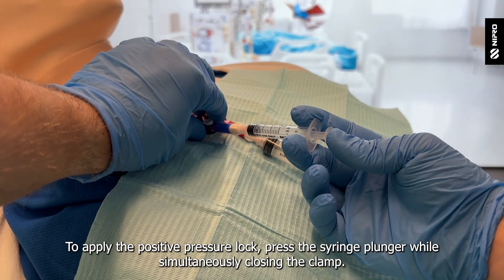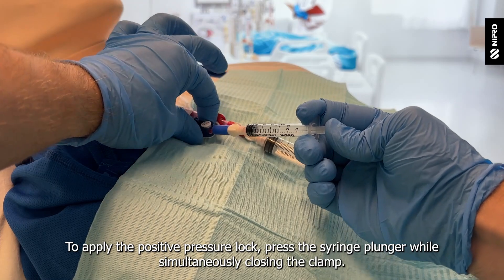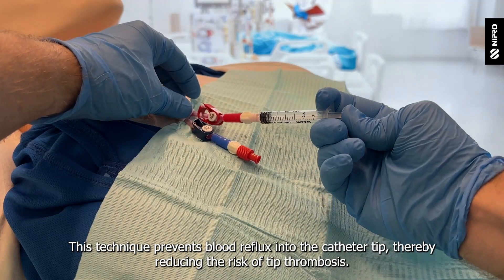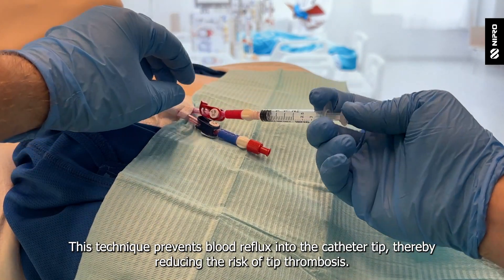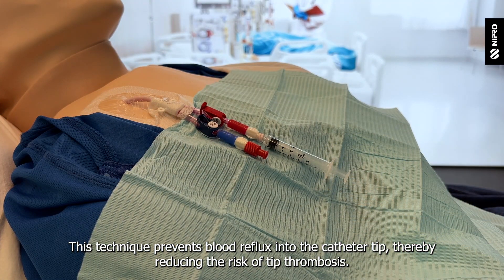To apply the positive pressure lock, press the syringe plunger while simultaneously closing the clamp. This technique prevents blood reflux into the catheter tip, thereby reducing the risk of tip thrombosis.